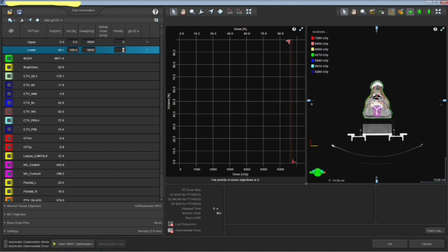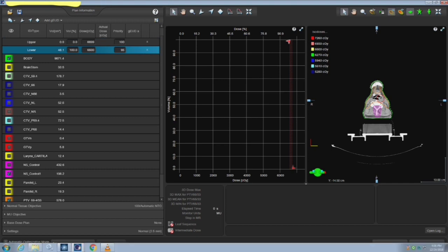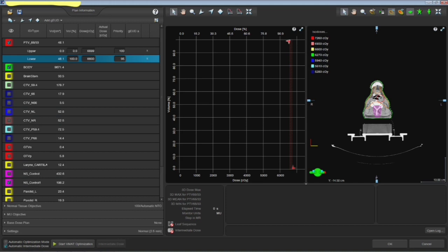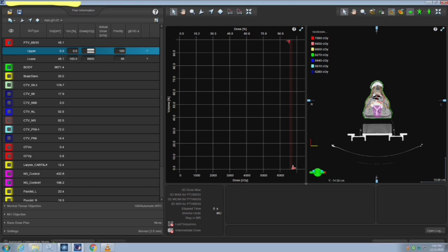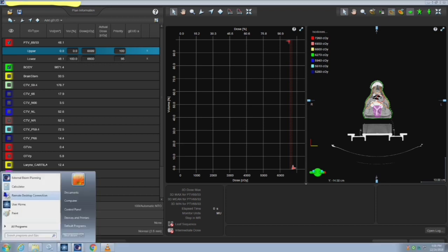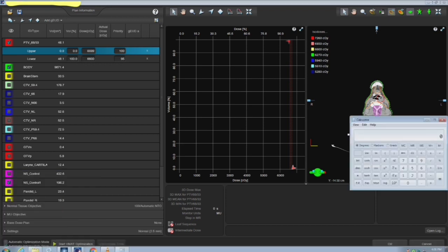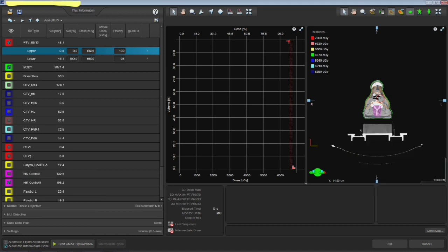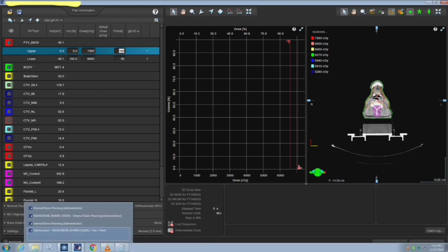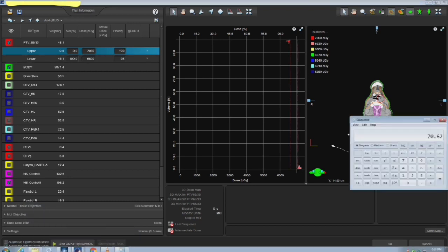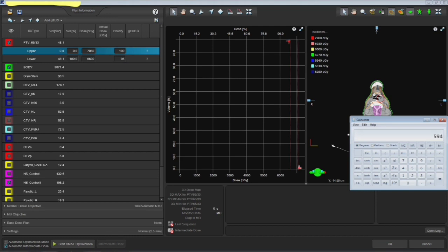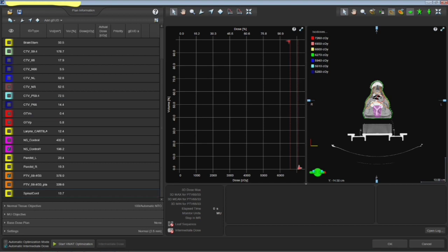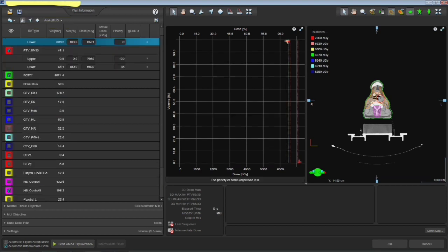Now one has to give the minimum and maximum dose to the PTVs. Minimum should be your 100 percent dose. The maximum should be 107 percent of the prescription dose. And it is very important, the priorities. One cannot, I mean, one should not simply give 200 or 150 or something like that. It should be 100, it is recommended.